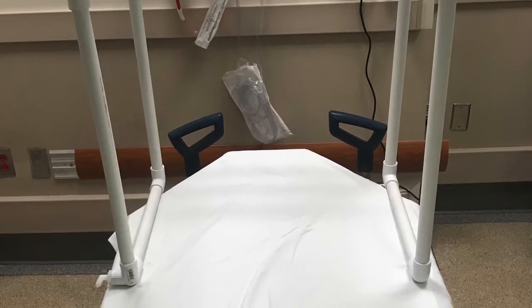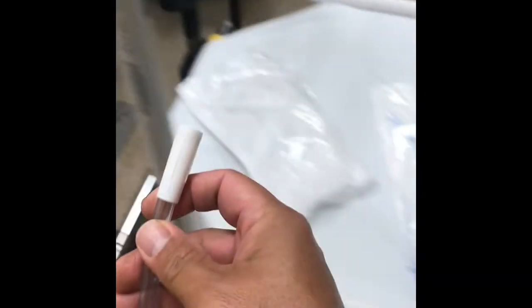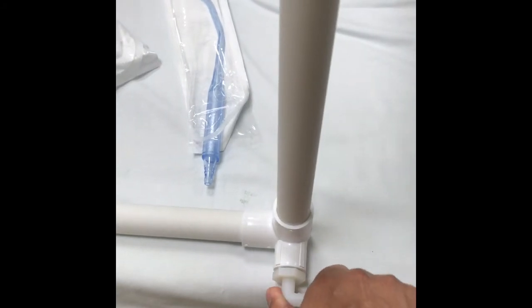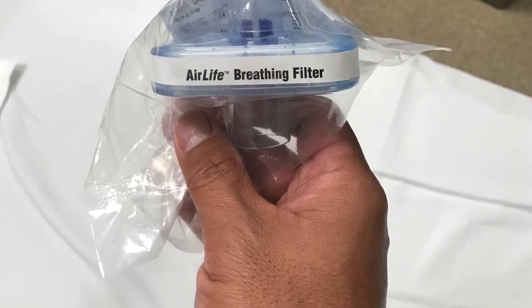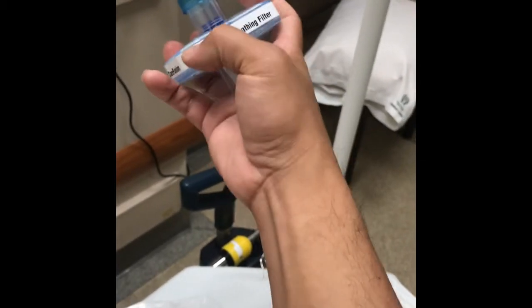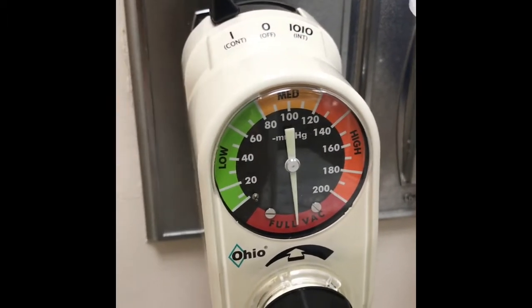At this point, all equipment necessary for intubation should be inside the NPE by the patient's face, including BVM and glide scope. A technician will take the hose from the wall suction and place it into the exhaust port located at the side of the NPE. Then a technician will place a viral filter at the top port of the NPE. Make sure suction is placed onto continuous and at maximum.